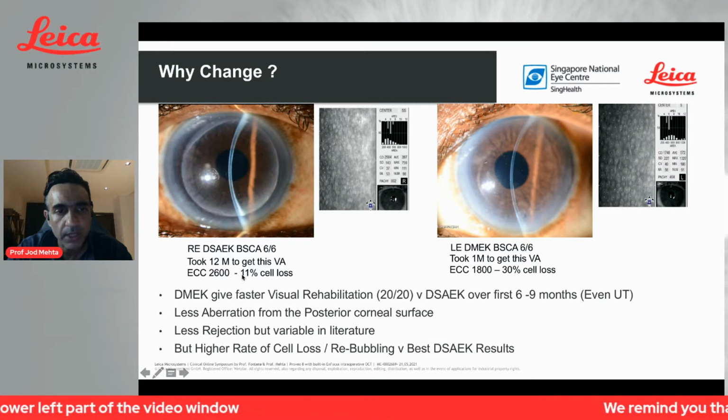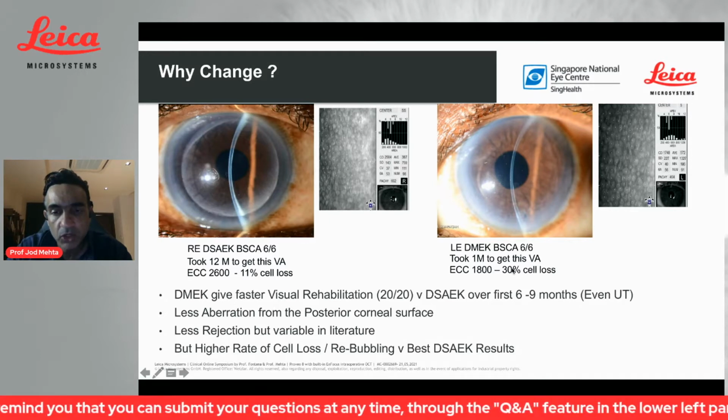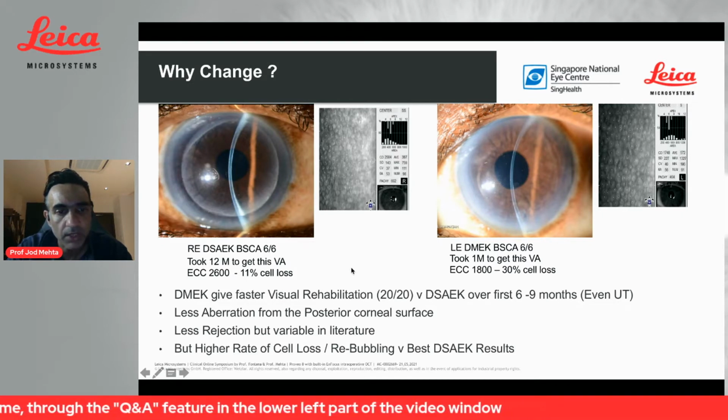It took 12 months to get that pretty good result, with endothelial cell loss of about 11% at 1 year. On the left-hand side, the patient sees the same visual acuity, but it only took about a month to get this level of vision, with a slightly higher endothelial cell loss. The DMEK is on the left-hand side and the DSEK on the right-hand side.